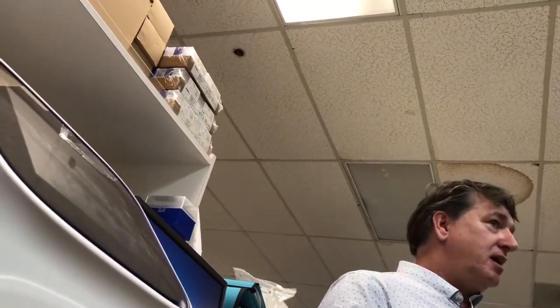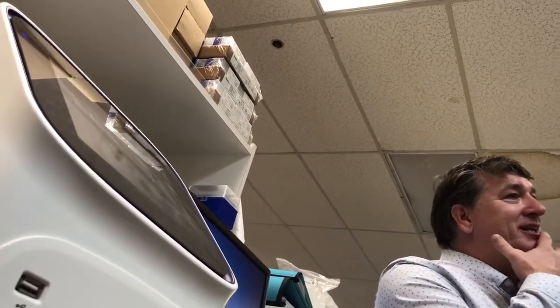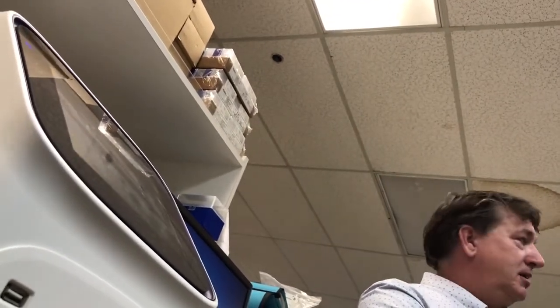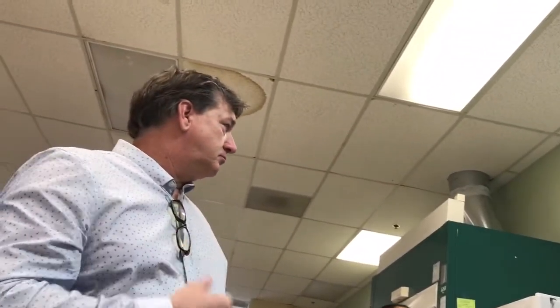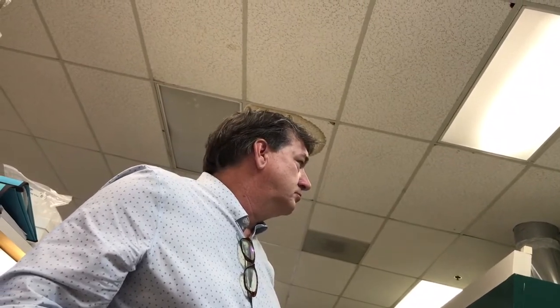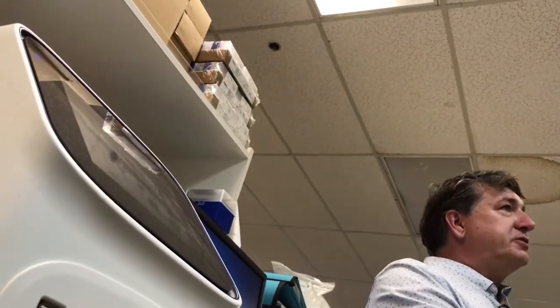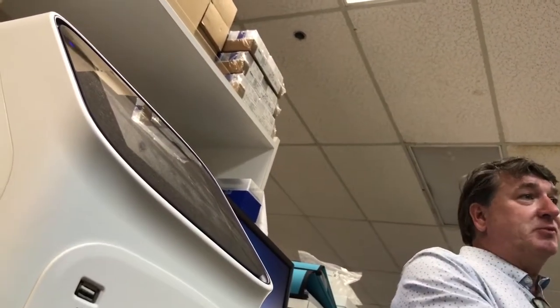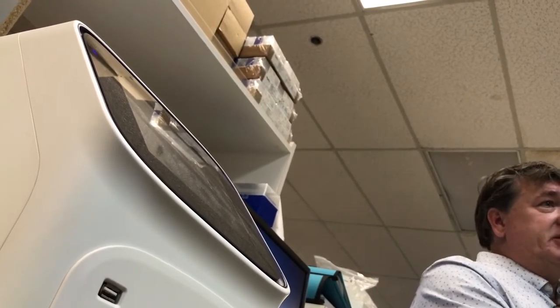How time sensitive is that? It depends on how the kit is made. You can make kits to test 10 samples at once. I'm talking about keeping the blood. You can store it, and you can keep it for a good amount of time. For viruses, it's usually fine. Viruses are stable in plasma if you're not doing anything to it. The plasma is heparinized, so it doesn't coagulate. It just sits there.